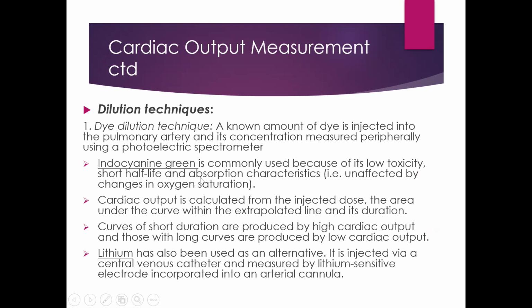All right, the dilution techniques. In the dye dilution technique, we have a known amount of a dye. Most of the time we use indocyanine green dye because of its low toxicity. It has a short half-life and very good absorption characteristics. What it means is that it is not affected by changes in oxygen saturation.